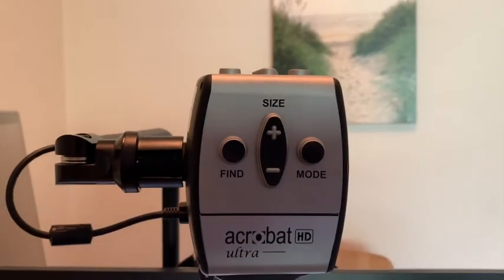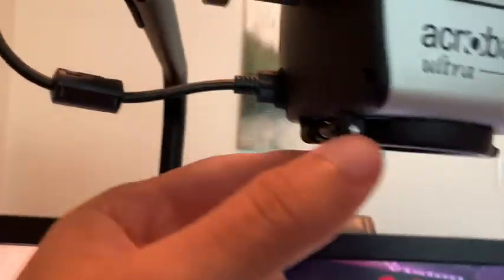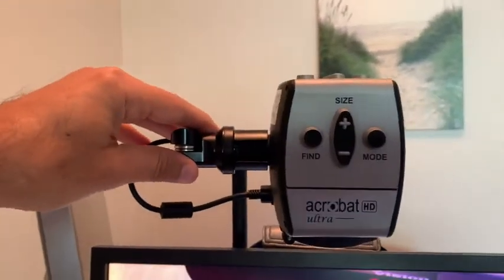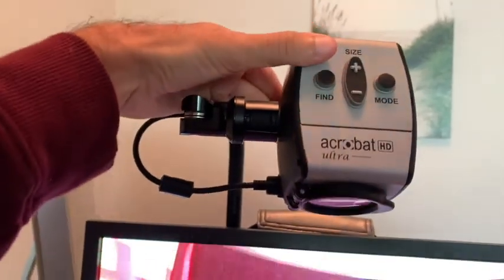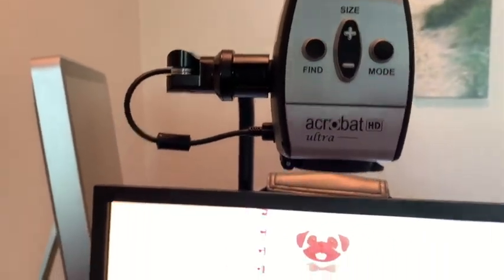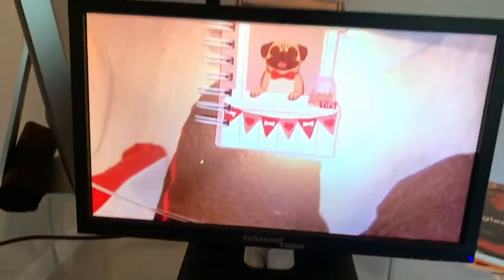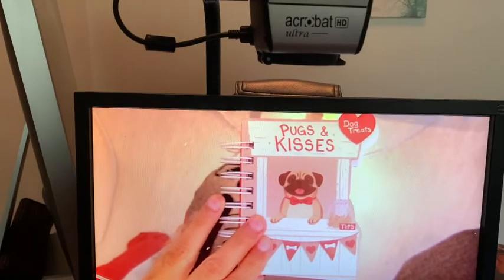This near and distance camera has a few different options, but the main thing you need to know is the lens is right here and it's connected to this arm that moves side to side, and the camera also tilts. For near viewing, you want the camera pointed down with the lens. I put a little notepad underneath and you can already see how large it's magnifying.